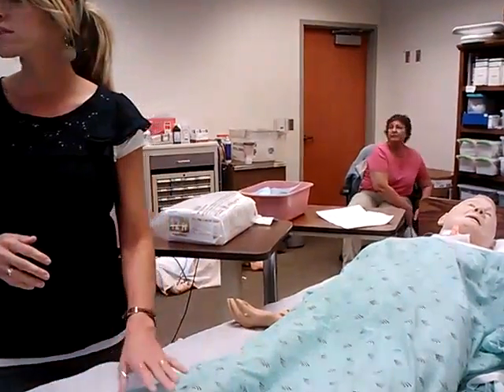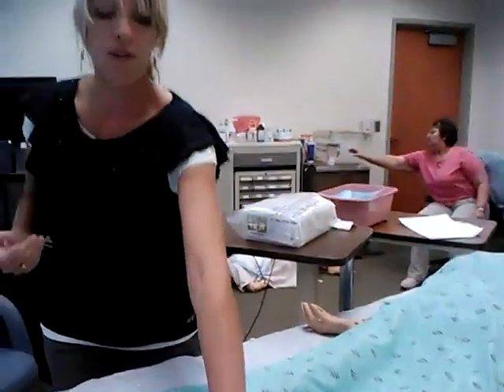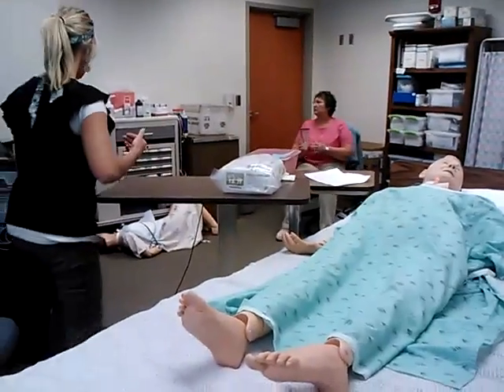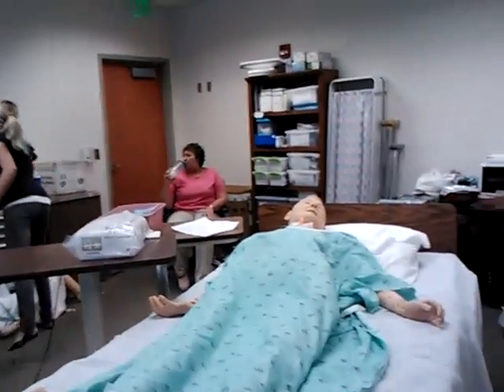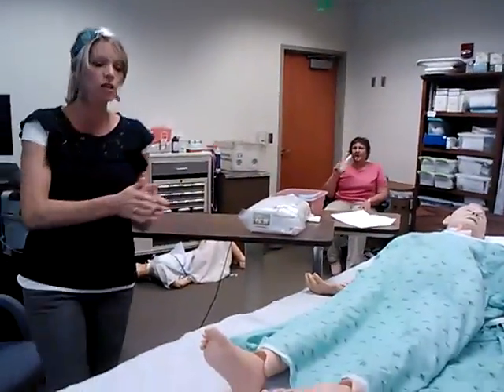On the male, you would do things a little bit different, and I'll kind of talk you through that as we go. So the first thing that you're going to do is you're going to wash your hands. Okay, so you're going to wash your hands.